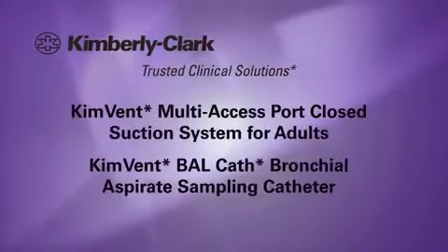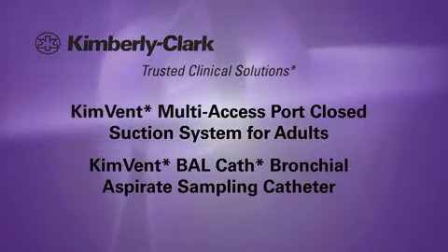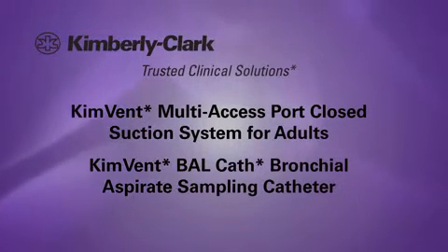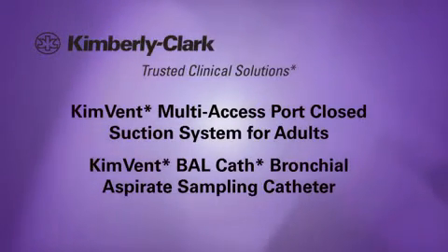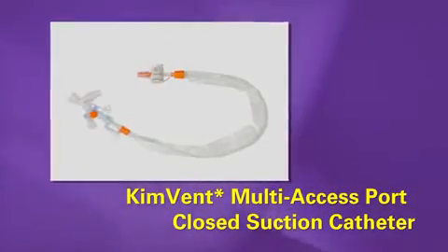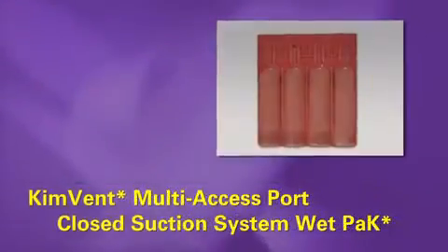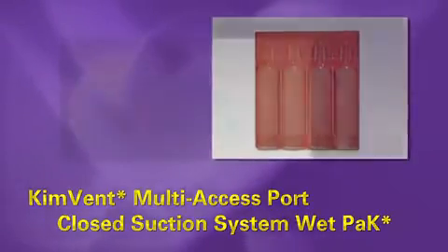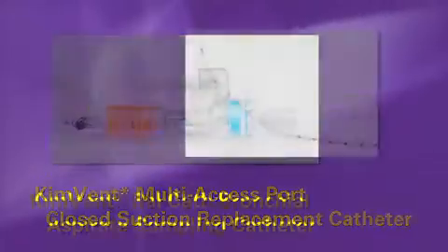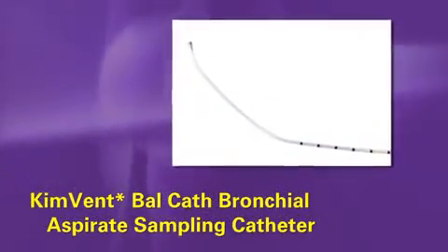Welcome to our demonstration of the Kimberly-Clark Kimvent multi-access port closed suction system and the Kimvent Balcath bronchial aspirate sampling catheter. The demonstration you are about to see applies to the following family of products: Kimvent multi-access port closed suction catheter, Kimvent multi-access port closed suction system wet pack, Kimvent multi-access port closed suction replacement catheter, and the Kimvent Balcath bronchial aspirate sampling catheter.